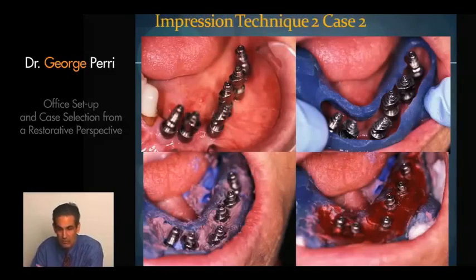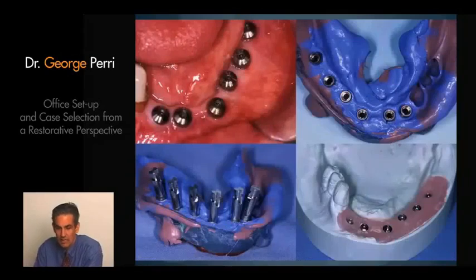And this was, admittedly, for me, the first time I used the technique. After we take the impression, we put the healing abutments back in place. Our impression we remove, we go to the lab, we connect analogs, and the laboratory will pour this accurate model, usually a soft tissue cast, so that we're not damaging the model just trying to remove the impression copings.